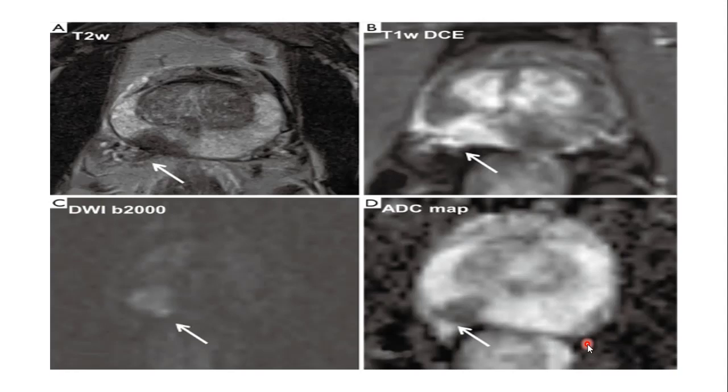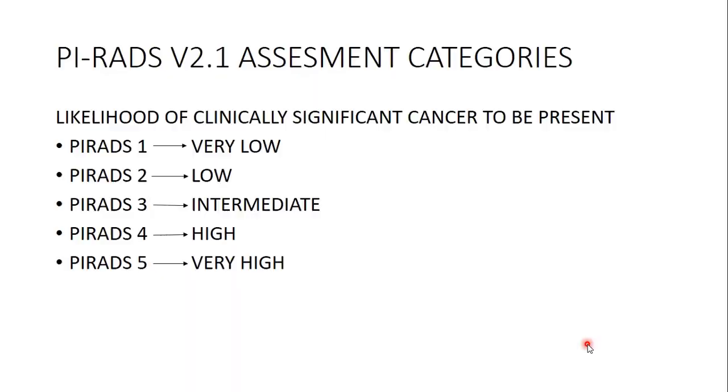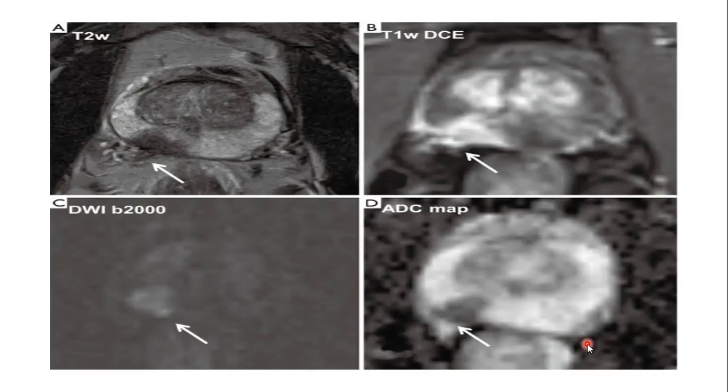There is now a multiparametric transrectal ultrasound. This is low cost, and it gives a lot of definition in more detail as compared to multiparametric MRI, which is rather costly. For that you need 3 Tesla, and the MRI available in Pakistan is not more than 1.5 Tesla. So it needs a lot of investment, and let's see what happens next in imaging.